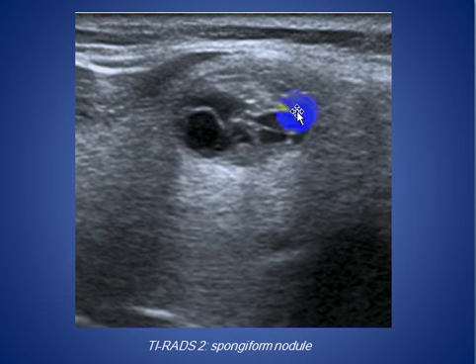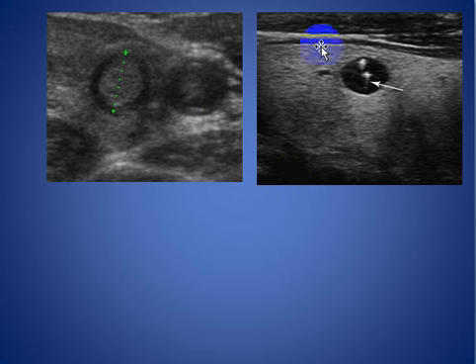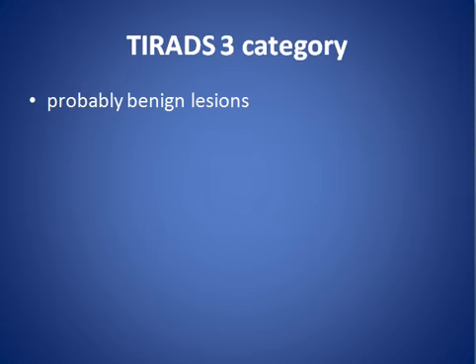And here this is type 2 also, TIRADS with a spongiform nodule with acoustic enhancement posteriorly, and here type 1 colloid nodule with aspects of hyperechogenicity, giving the appearance of comet tail artifact, and this is colloid type 2 surrounded by halo.